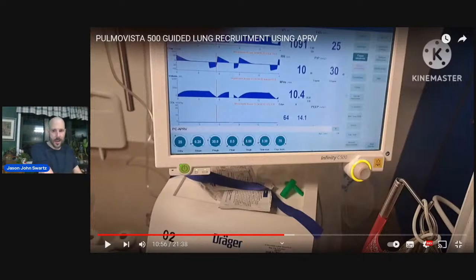We had a setting of PEEP of 10, delta P of 15, which makes a plateau/peak inspiratory pressure setting of 25, right? And it was pushing 25. Okay, so delta 15, peak pressure 25, had a rate of 22 to 24, and about half the lung was missing.